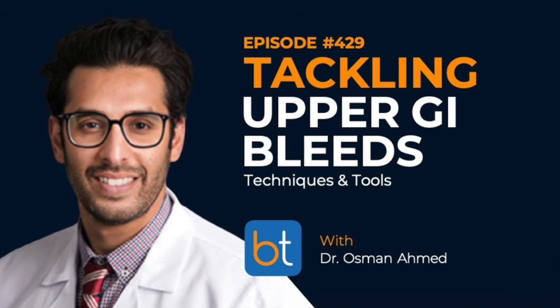And I think where it's best used, following the IFU, is in vessels that are less than 3 millimeters in size, where you have a long landing zone, where you have some forgiveness. There is a learning curve to using this. This is not a liquid in terms of the way a liquid behaves when you exert force on it. It takes a lot more injection force to get it out of your microcatheter. So there is a learning curve in getting comfortable with the force that's required.